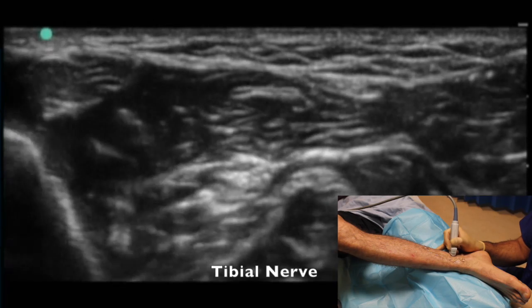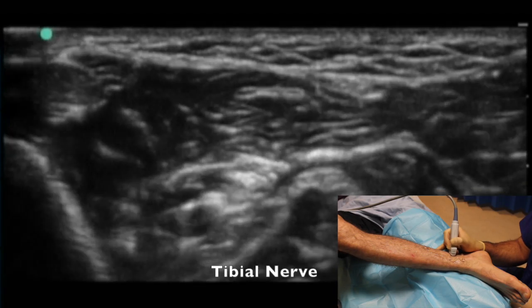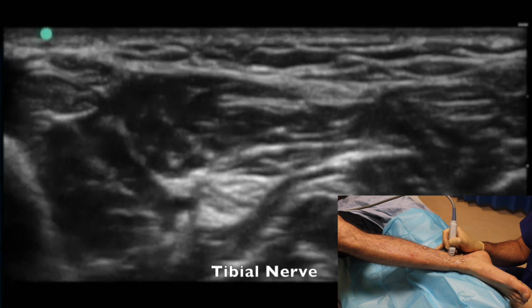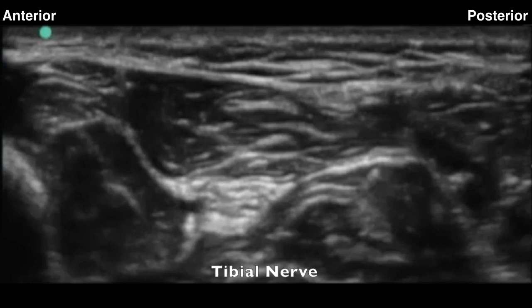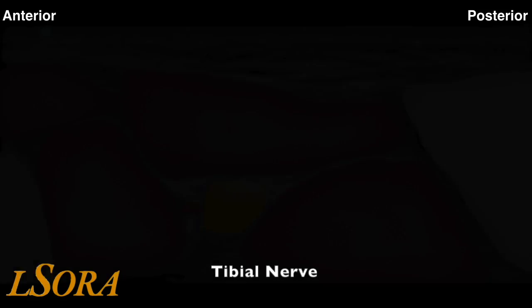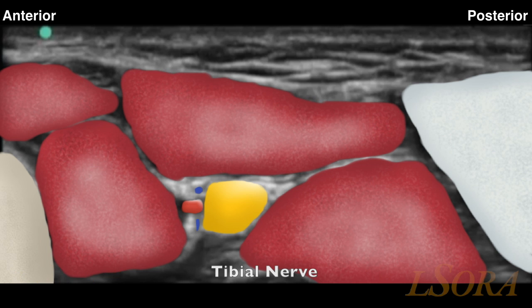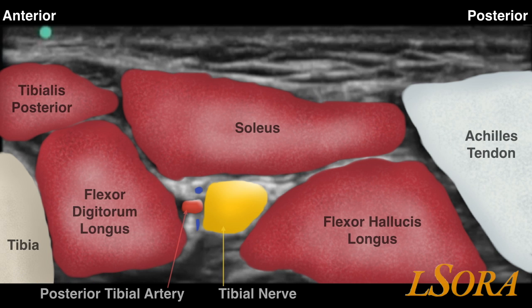We start scanning for the tibial nerve distally and then slide the probe proximally. The left-hand side of the screen is anterior and the right-hand side of the screen is posterior. The anatomical structures are annotated here for ease of identification. Note the tibial nerve in the centre of the screen.